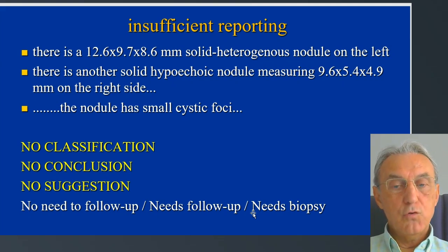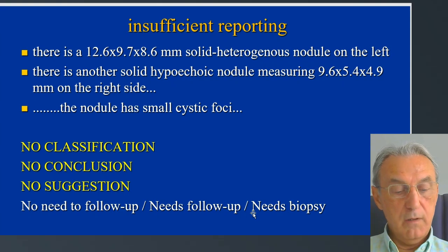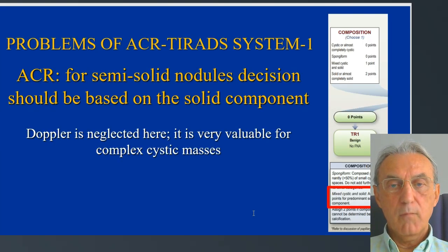We can choose not to follow up, no need to follow up. The nodules may need follow-up, or the nodules may need biopsy. We should all comment on these.